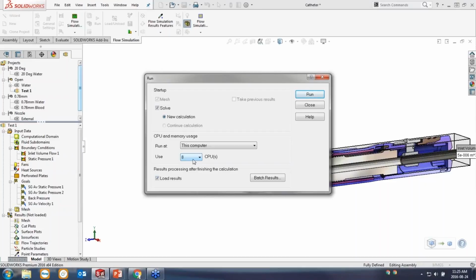I've got a question come in here, whether I'm monitoring average velocity or max. Great question. I'm monitoring average velocity, but you could definitely set it to monitor the maximum across that face as well.